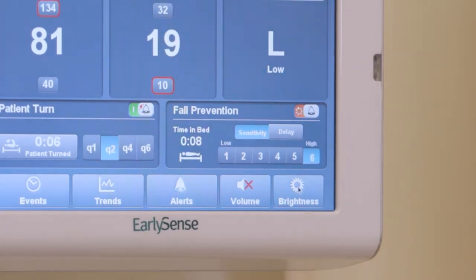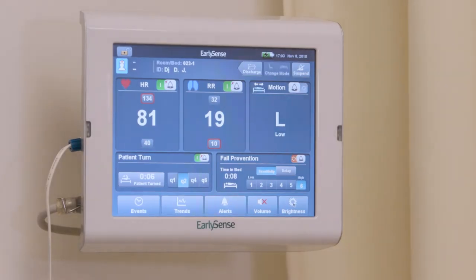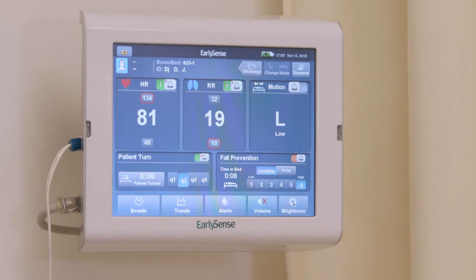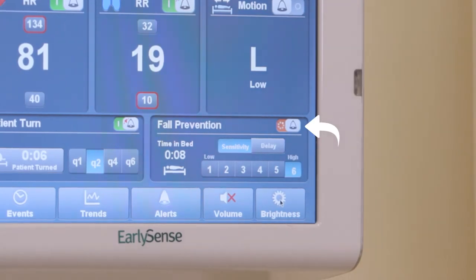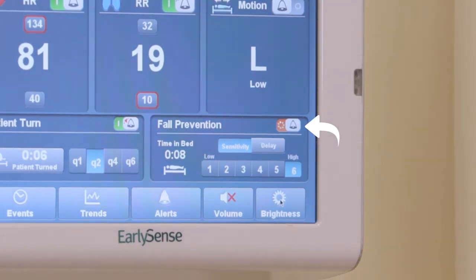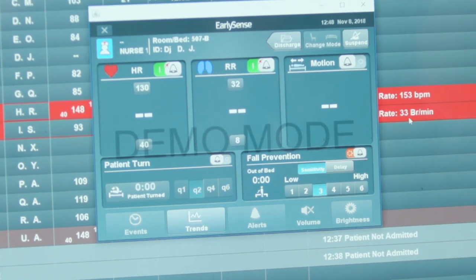a short period of time is required by the system before a bed exit alert can be generated. During this time, the fall prevention alert icon status shows a not ready indication on the bedside unit and in the patient's fall prevention column at the central display station.